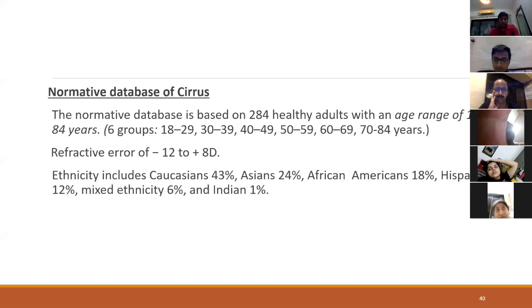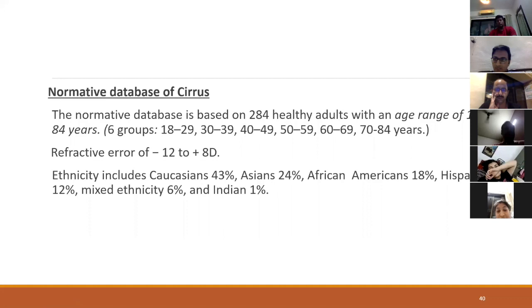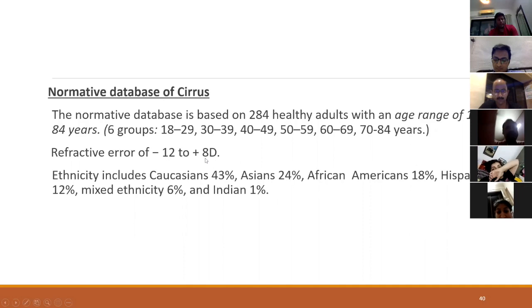The normative database for the Cirrus covers an age range of 18 to 84 years. If a patient is younger than 18 or older than 84, normative database comparisons will not be available or accurate. Refractive errors outside minus 12 to plus 8 diopters — such as high myopes or high hyperopes — may produce many artifacts in the reports and inaccurate scans.